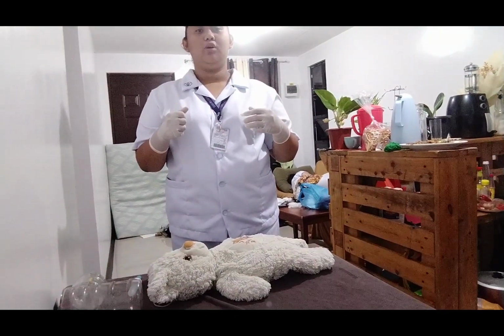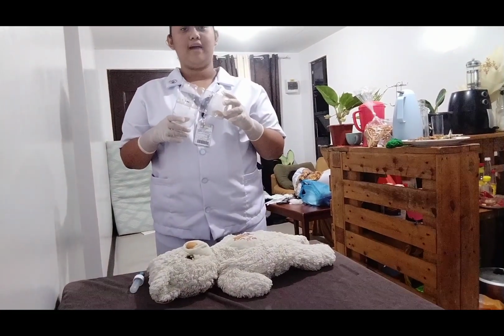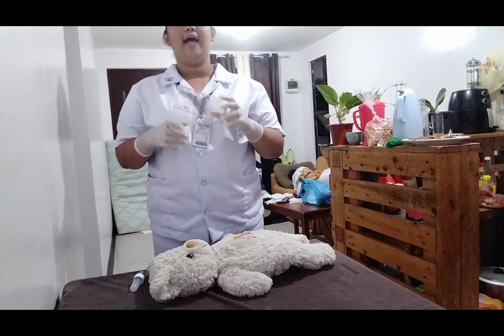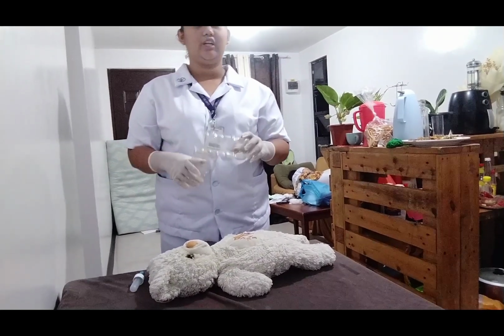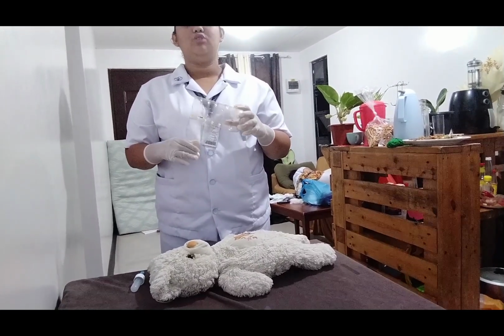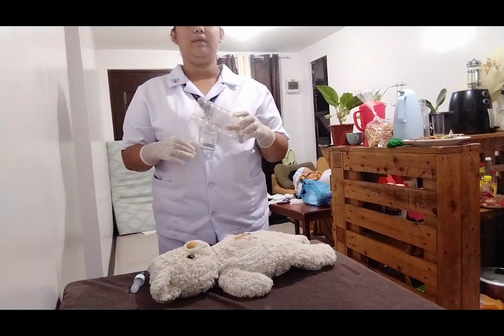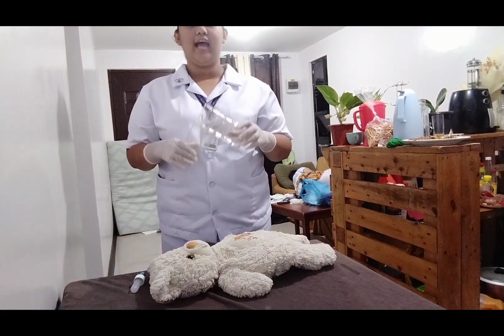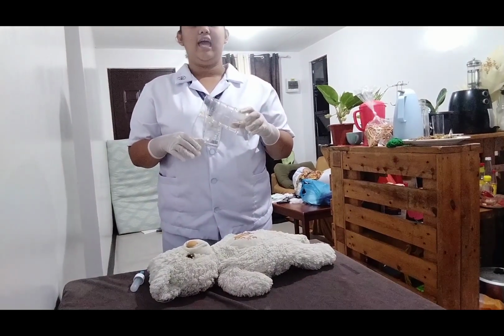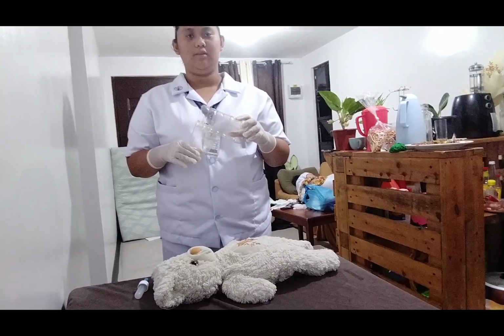For this demo, I am going to use the bag valve mask. So here is my bag valve mask. What I'm going to do is cover the baby's mouth and nose with it. Now, hand position: the thumb and forefinger of one hand will be placed at the rim of the mask. Then, to ensure a good seal, the remaining fingers will be placed on the jawline of the baby. This is done so that our hand is not leaning on the baby's eye and compressing the baby's neck, and is supporting the baby's head. So, we'll be delivering oxygen to the baby.